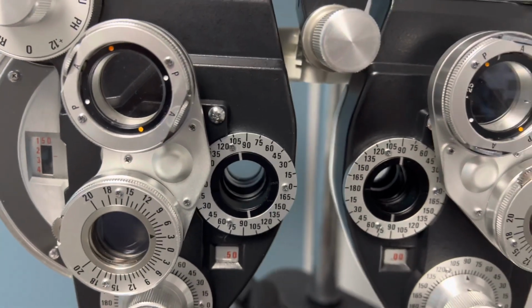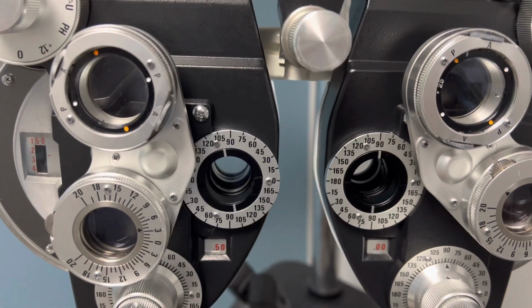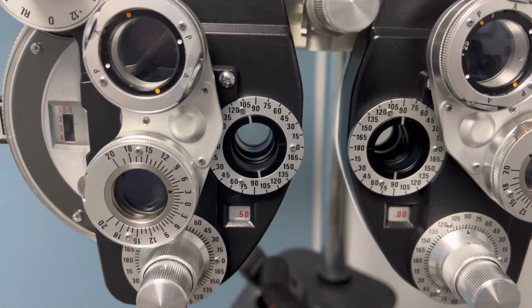So in general, when you're doing this, if things look the same, it means we're pretty close, and either one of those lenses is going to help you see better. So hopefully that helps you understand a little bit more about what's going on, and hopefully you feel like I'm not trying to trick you when we're doing this exam.